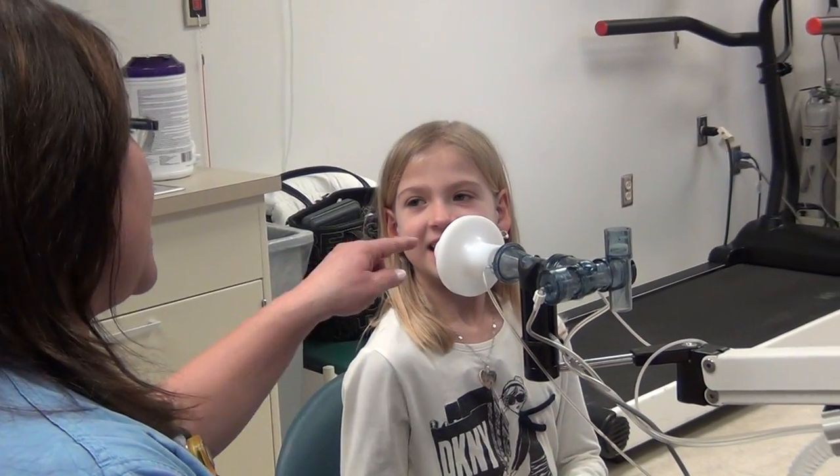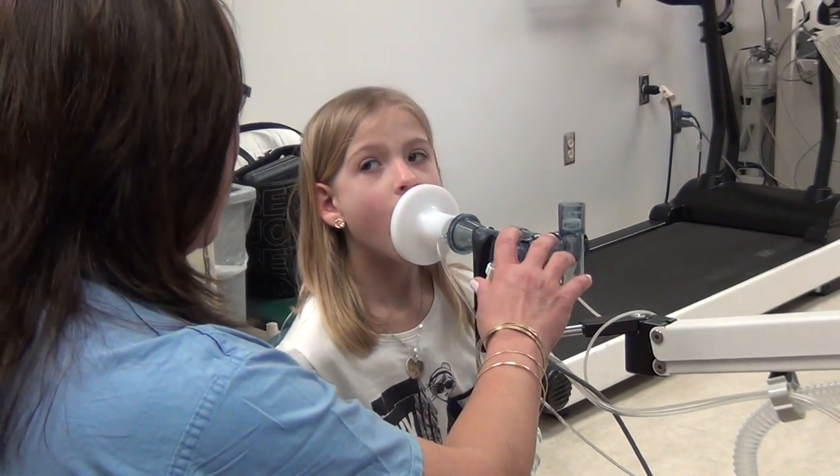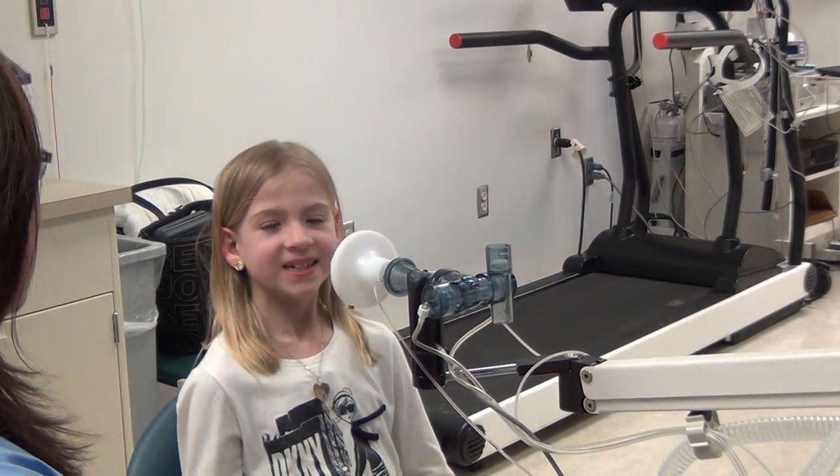We're going to start off — you're going to get on that mouthpiece. Your lips and your teeth have to come up over that, just like that. And we're going to bring it here. Come on up, we're going to put your nose clip on.